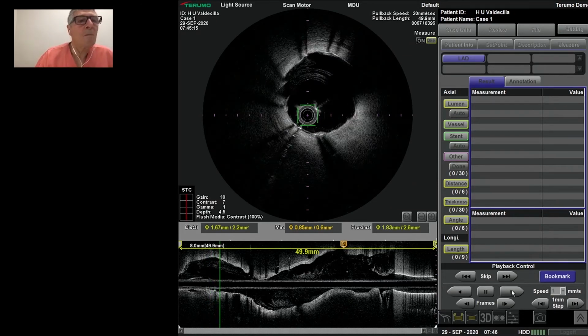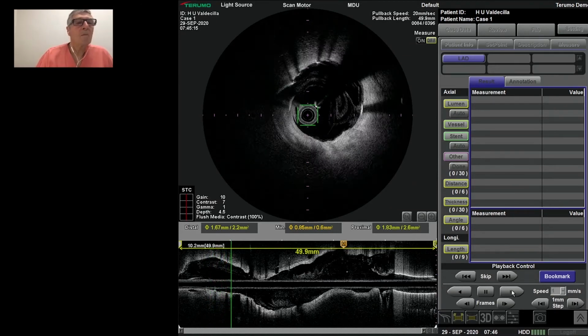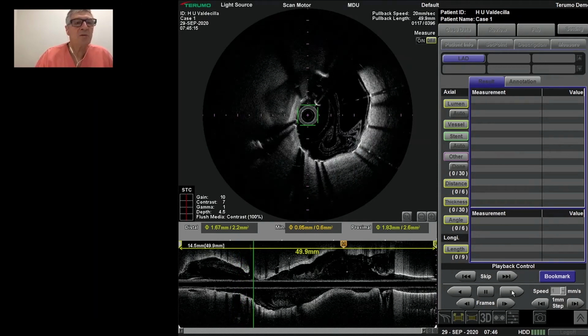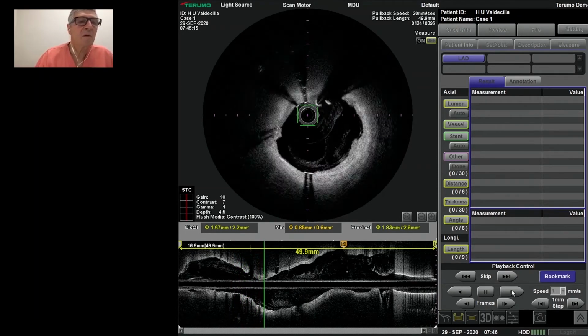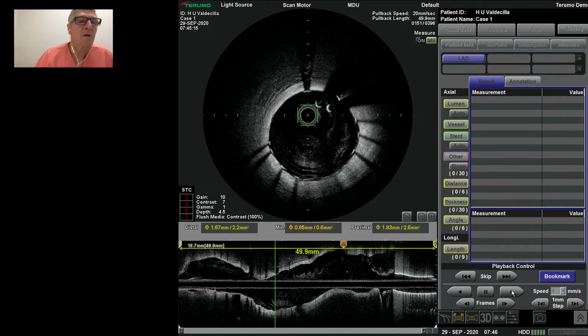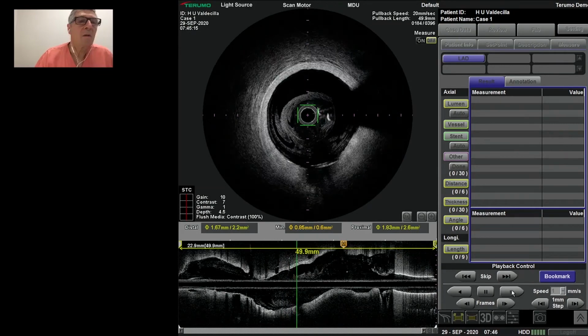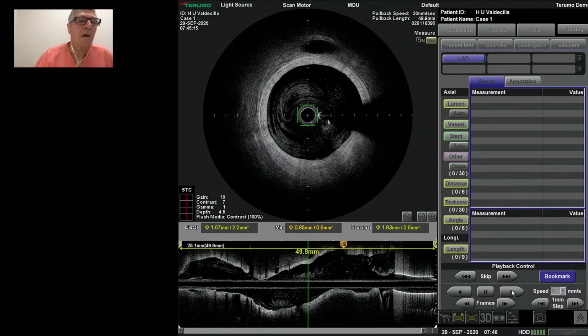This is the stent. Nicely opposed and expanded. Yeah, good. Let me see the transition between. Look at the bifurcation, the other wire. Of course, and eccentricity in the polygon where the plaque was. And very, very, very mild malapposition. Vete a la proximal, vete proximal.